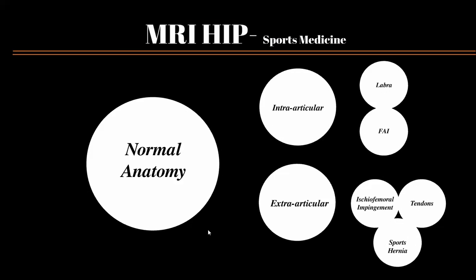So we come to the end of the lecture, and the take-home points are that hip pain is very, very difficult. I mean, we haven't even talked about osteoarthritis or infections or bone lesions, but to diagnose it is very difficult on clinical examination. X-rays are good, MRIs are essentially the gold standard, and you're not expected to make these diagnoses yourselves, and actually your radiologist can help you not only diagnose the pathology but treat the pathology as well, because we can reach most of these places under image guidance with a very thin needle and inject steroid or anesthetic just to confirm or refute the diagnosis.